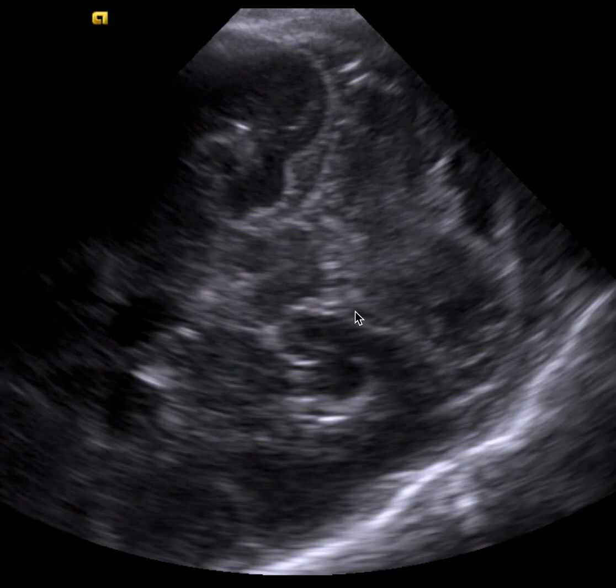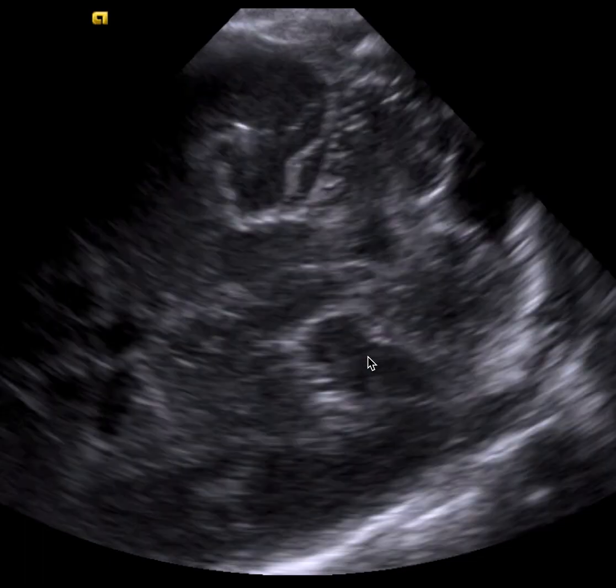Right now the probe is pointed more anteriorly. If I point it more posteriorly, like so, we'll see the cisterna magna open up and also see our fourth ventricle. These transmastoid views are valuable for assessing for cerebellar hemorrhage, which will start acutely as a hyperechoic area and subsequently become isoechoic and finally hypoechoic. This concludes our review of the midline structures of the brain. Thanks so much for watching.